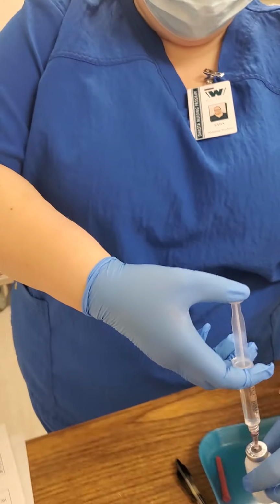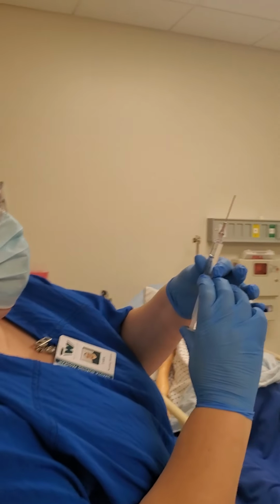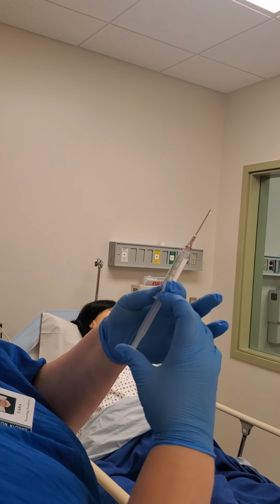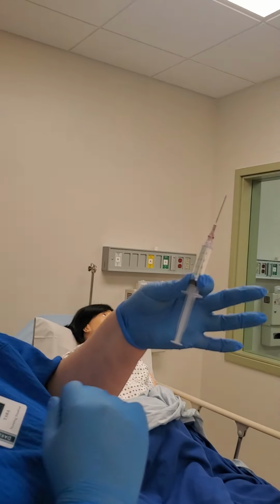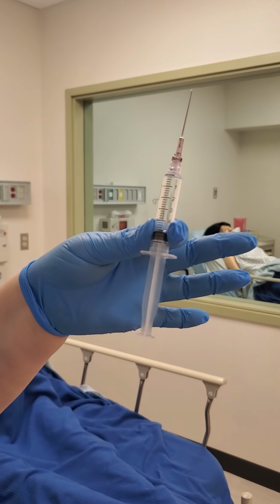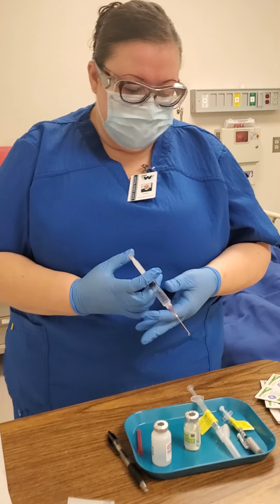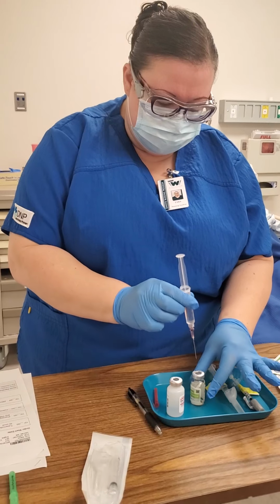Okay. milliliters. Can you see it? There. Okay. Oh, so shaky.